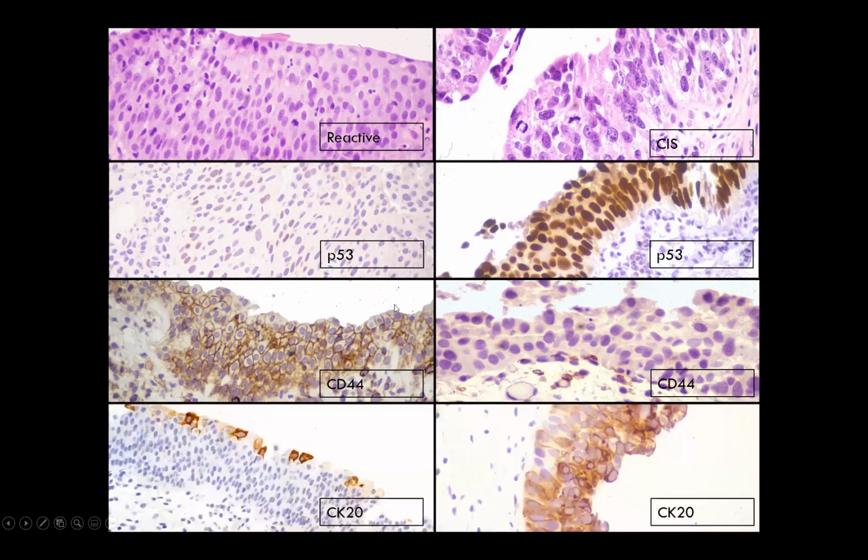And then finally, we have CK20, which in reactive conditions should stain only the top layer, or the umbrella cell layer. However, in carcinoma in situ, it most often stains the entire thickness of the urothelium. So this would be your ideal situation. And when one sees this, one might think, okay, this seems to be very useful. So why do we need to struggle with morphology? Let's just use IHC for all these cases.